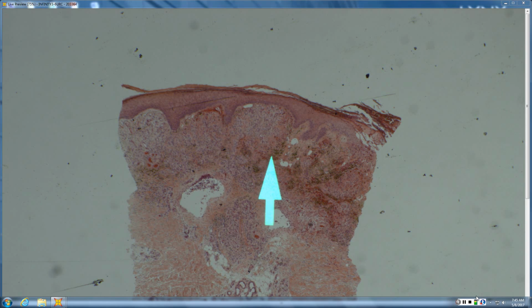Brown pigment in skin can only be one of three things, either clinically or histologically. It's got to be hemosiderin, melanin, or lipofuscin. In this case, you correctly saw the red cell extravasation, and so characterized it as hemosiderin. It's a chronic condition, with compact corneum, epidermal hyperplasia, and then nodular angioplasia puts you on the shin, and stasis dermatitis.